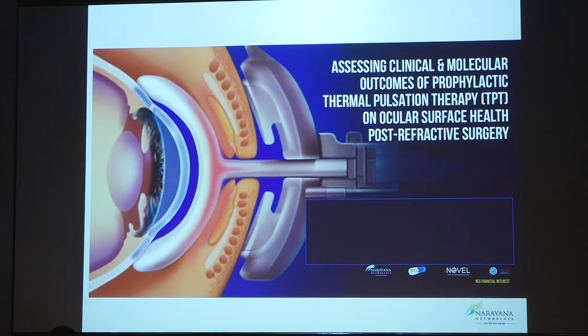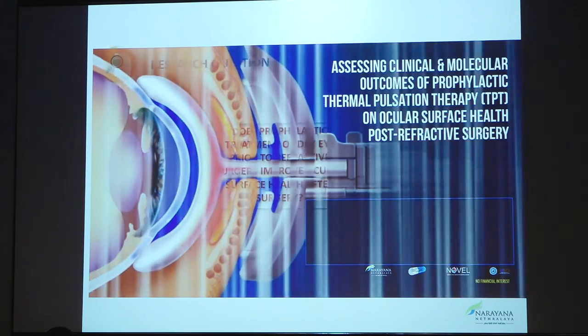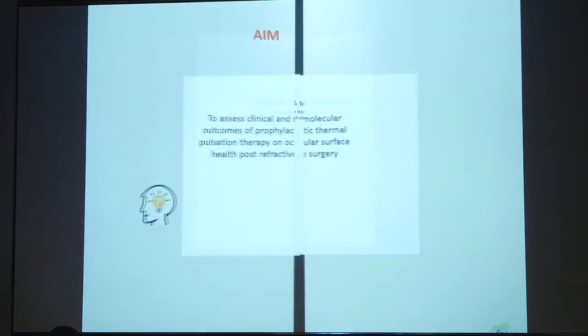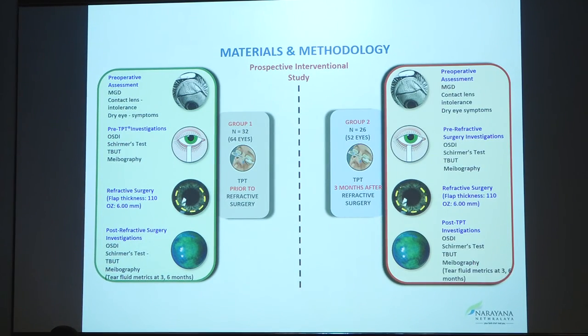So I've used only LipiFlow here, but it can work the same way for Eye Light or IPL. What does it actually do when a patient comes to you who has this kind of challenges, which are not getting treated with your conventional therapies of medications? This was presented in part at the ASCRS meeting, molecular and other factors, what happens when you do this. We did it for refractive surgery, but it's exactly the same when you do it before cataract.